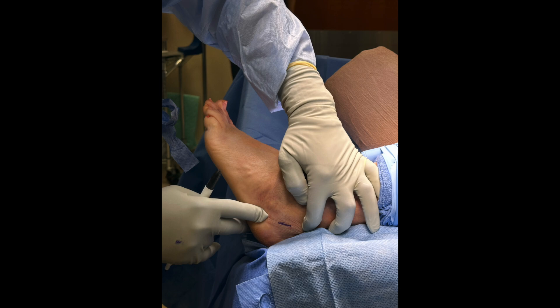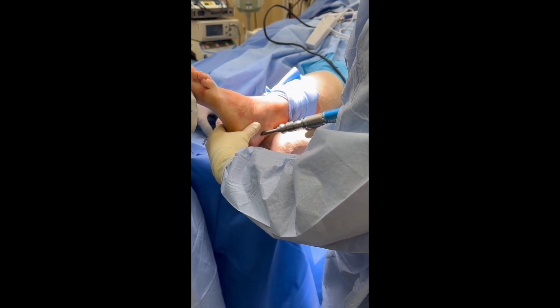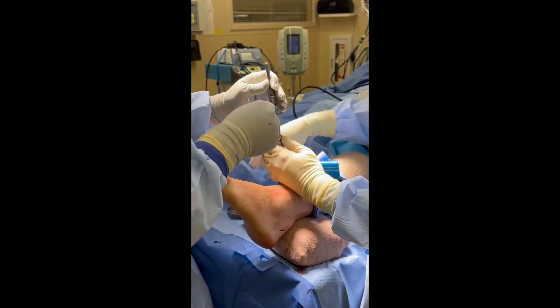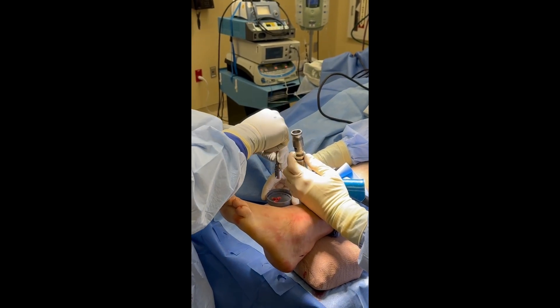We begin by harvesting calcaneal autograft. An oblique incision is made over the lateral calcaneal tuberosity in the sural nerve safe zone. Dissection beyond the dermis is blunt in order to reduce the risk of nerve injury. An 8mm bone graft harvester is utilized, making multiple passes to collect an ample amount of graft for later use.